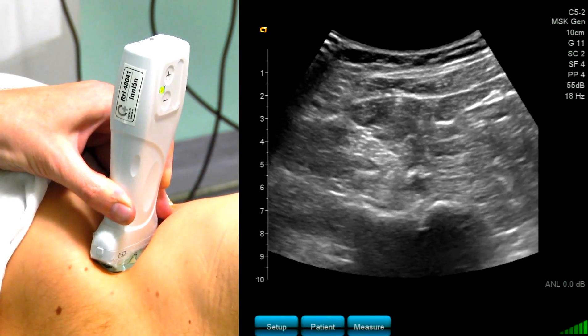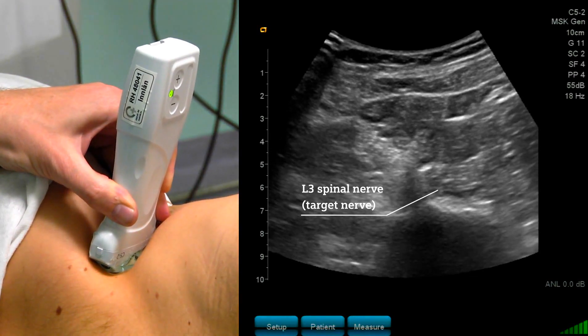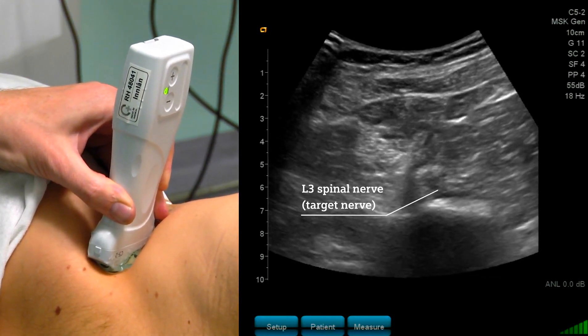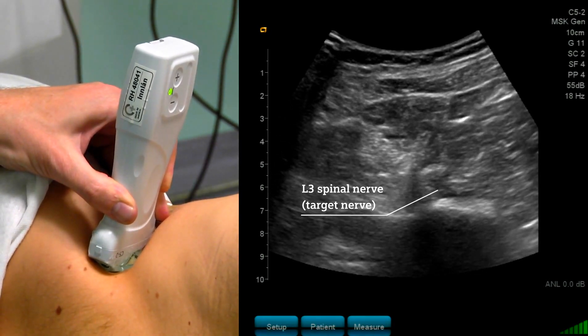I turn my probe back caudally. The L3 spinal nerve appears again, and you see this as a bright hyperechoic structure.